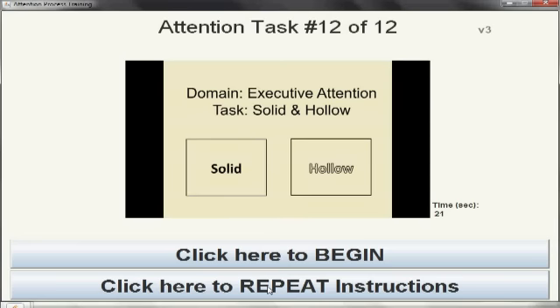This task is designed to help practice your ability to shift your attention between tasks. You are to shift between pressing the buzzer either when the actual word matches the letters or when the actual word does not match the letters. Let's try a few together first.